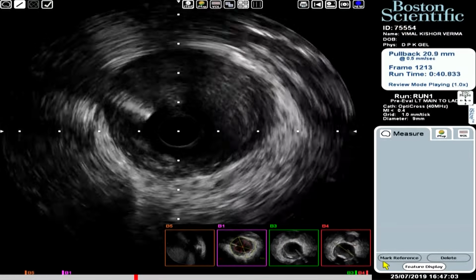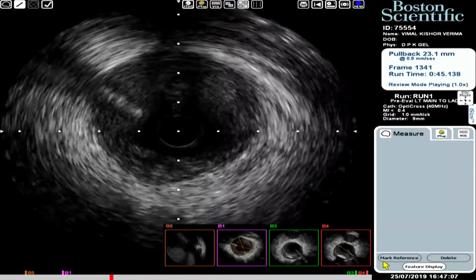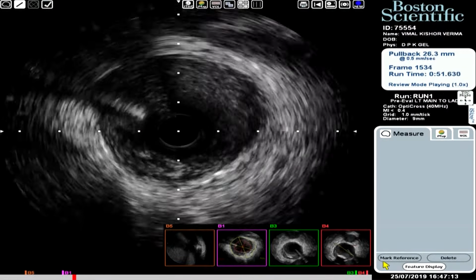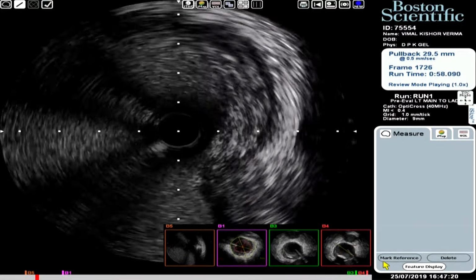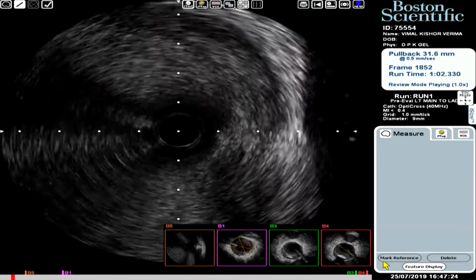And that's the left main. And the left main is nearly 1, 2, 3, 4, 4.5 to 5. It's 4.5 to 5. And till the ostium there is plaque. Can you see there is plaque? Yes. From 12 o'clock, till the ostium of the vessel? Yeah. So we're just getting out of it. So that is it.